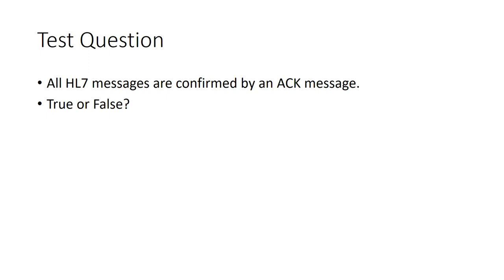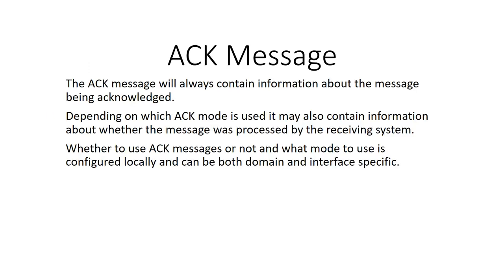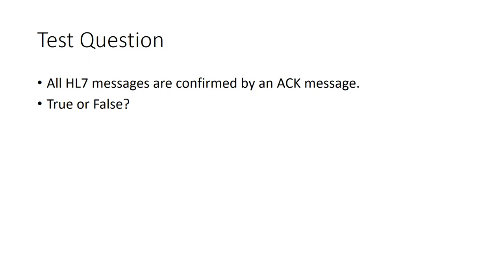Test question. All HL7 messages are confirmed by an ACK message. You think that's true or false? That's false. Let's go back one. Whether to use ACK messages is configured locally, right? So it's up to the PACS admin to choose which messages he wants to send acknowledgments for. So that question is obviously false.